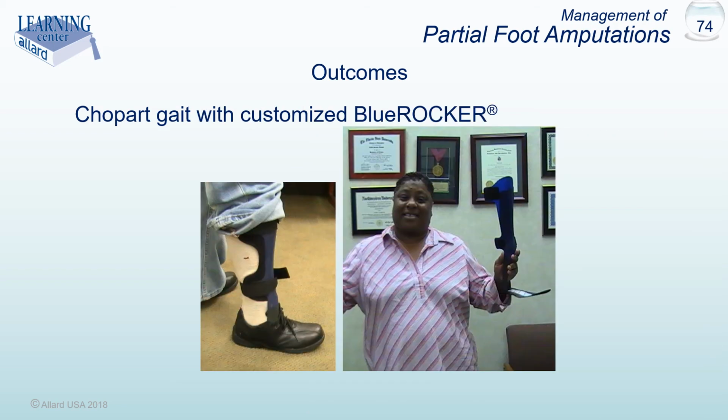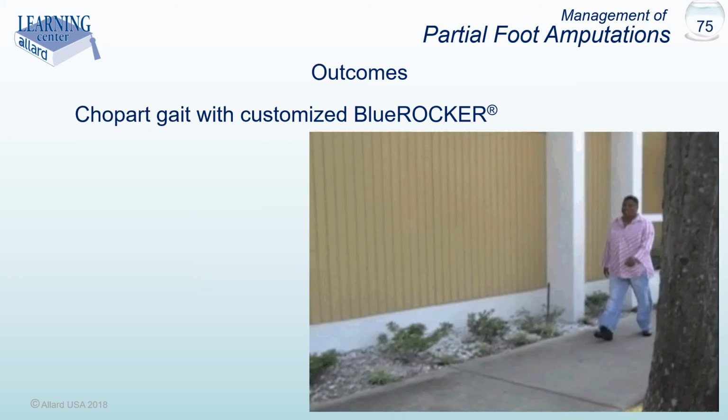The same patient then received the device as described in this program. It is a blue rocker with a socket and a filler prosthesis. She had some plantarflexion contracture, so the calcaneal angle is not quite back to neutral. Notice not only the improvement in gait symmetry, but also how freely her trunk is going along for a ride on top of her pelvis. In her book Gait Analysis, Jacqueline Perry describes that as being functionally stable gait.